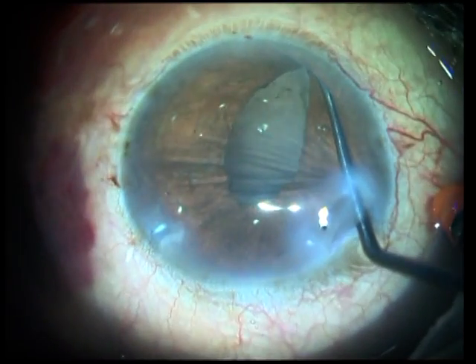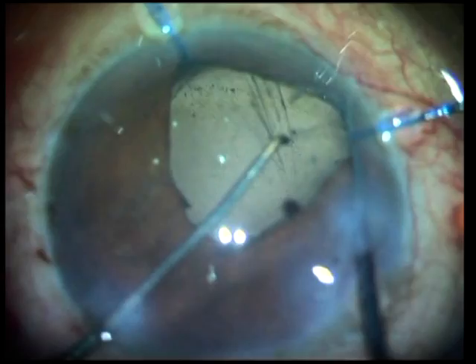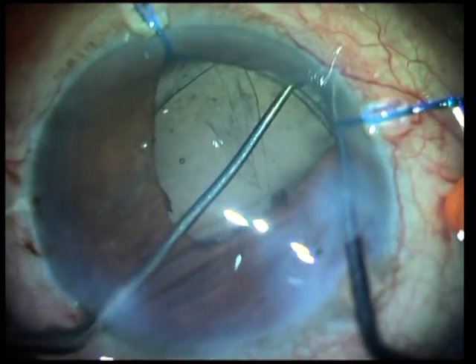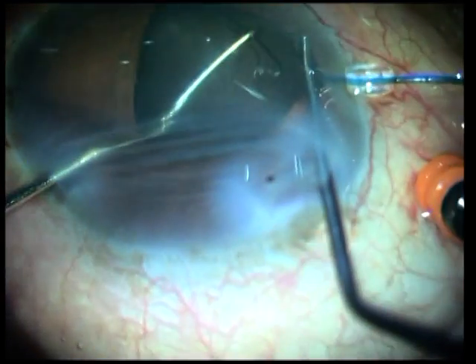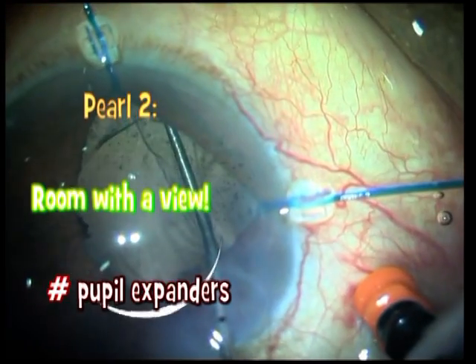It's difficult to release it from the Sinski hook sometimes, and even when you do know that it's gone under the iris, you're not sure whether it's gone over the sulcus or into the bag. In this case, after dilating the pupil, it's seen very clearly that it was accidentally released over the sulcus. So here's pearl number 2.